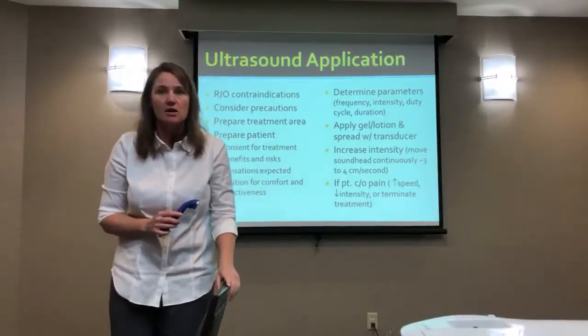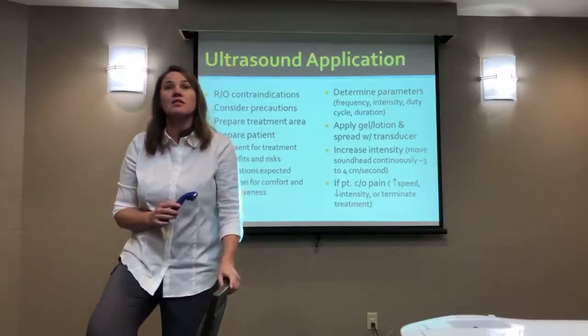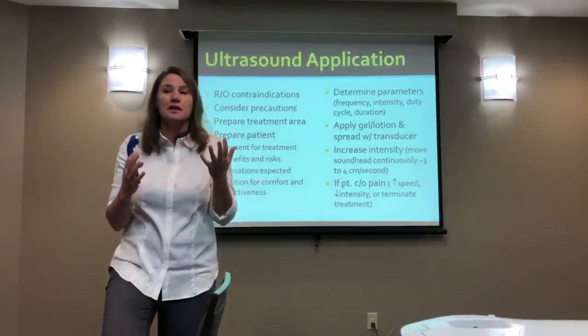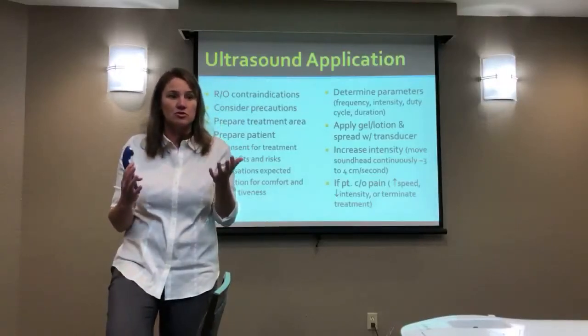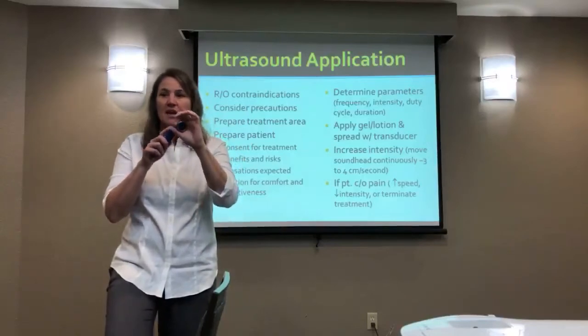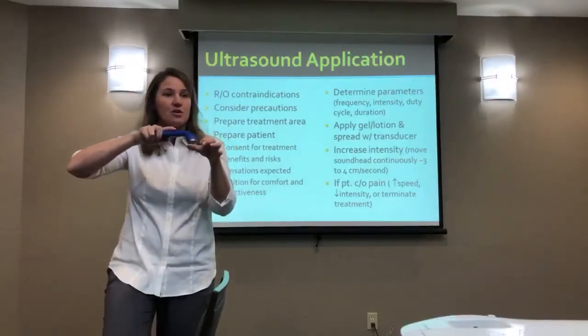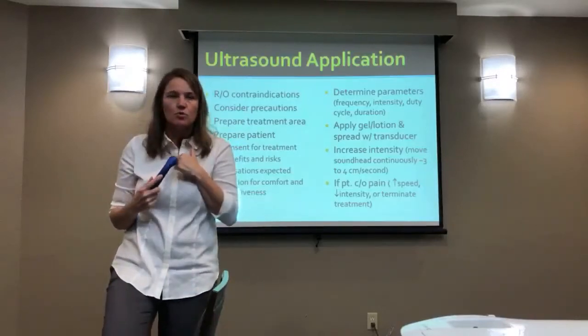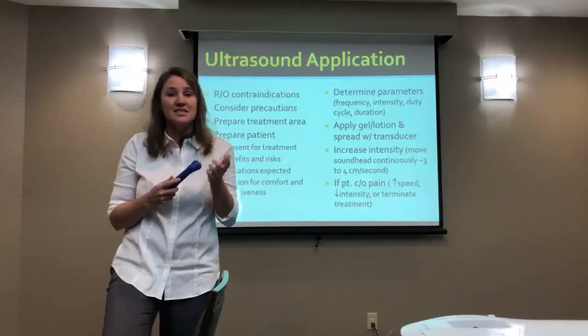One of the things I say a lot, and I think one of the things that makes ultrasound not repeatable, and something we were talking about, is trying to make controlled studies that are truly controlled. If they don't use, for example, a template and a robotic arm to deliver that ultrasound, how do I know that you did the same thing that I did? How do we know that our treatment was delivered the same?